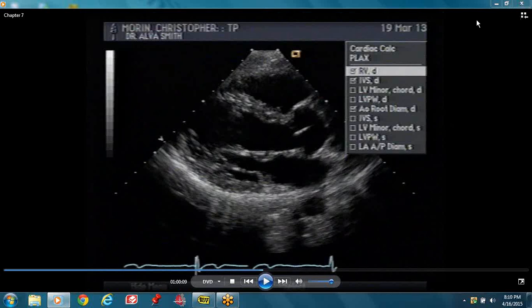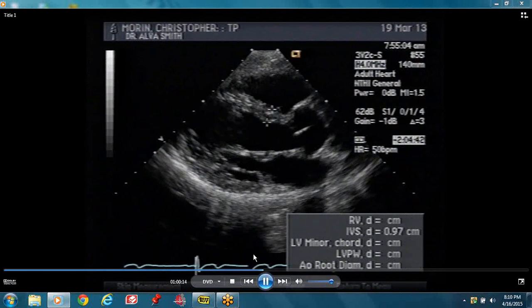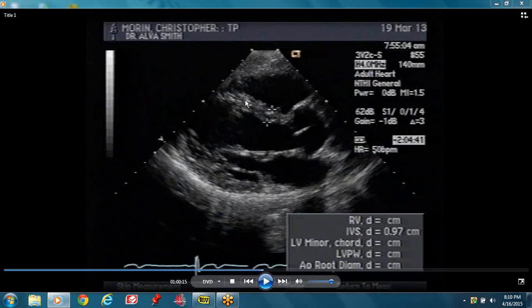This is a normal study. This is a parasternal long axis view. You have the right ventricular outflow track up here, this is the septum, and you have the posterior wall. Attached to the posterior wall, you have the posterior mitral leaflet, and then the anterior mitral leaflet.